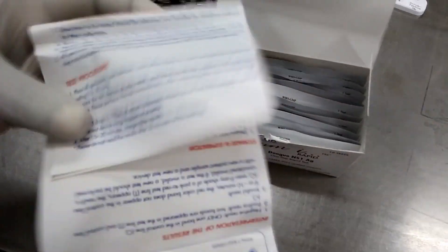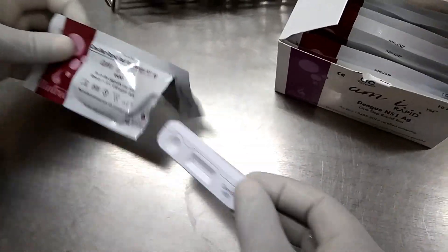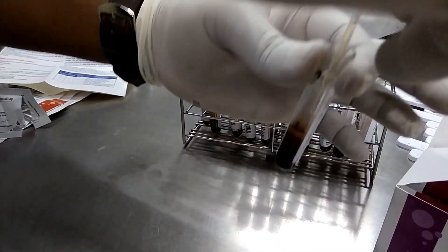Now take out the test device from the test kit packet. Open the pouch and take out the test device and dropper, which is given in the pouch. After that, with the help of the dropper, load 3 drops of serum, as shown here. And leave for 15 to 20 minutes.